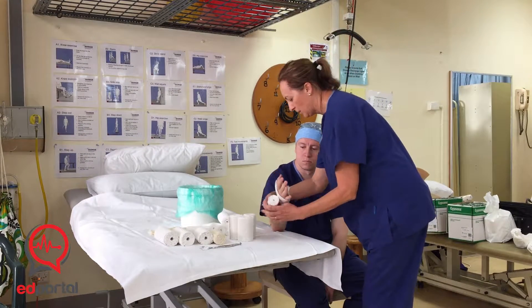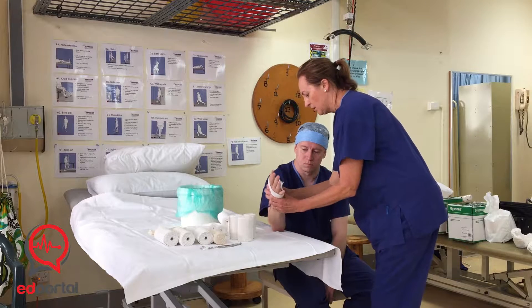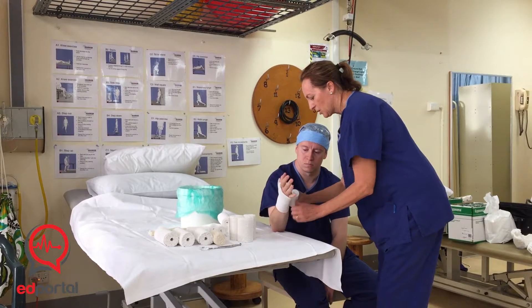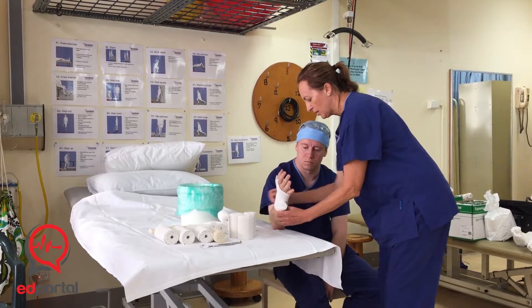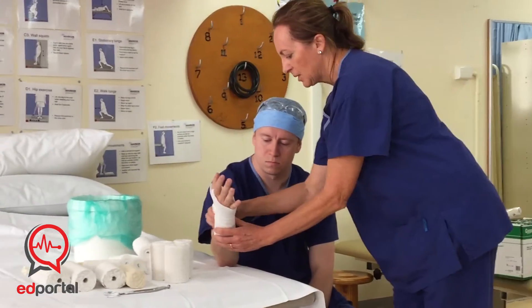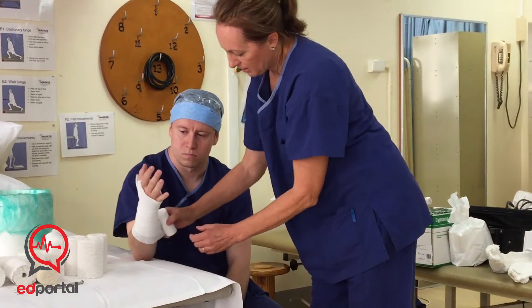What we're looking for is a good fit of the cast. We want it to sit fairly close to the skin, so don't put too much webbing. You just need a layer or two layers there — you don't want to be able to see the skin through it. It's pretty user-friendly.